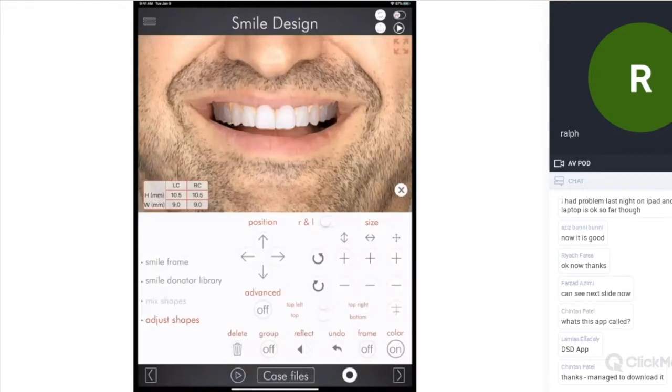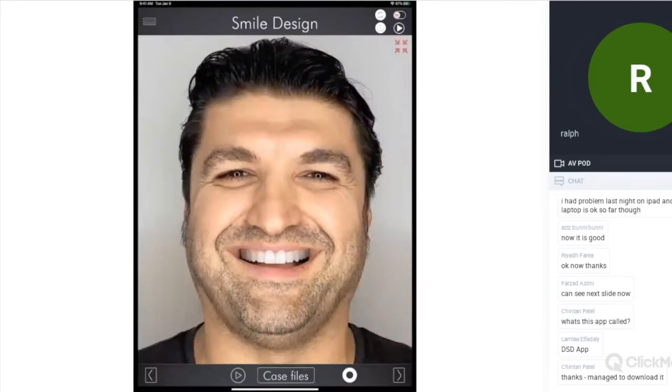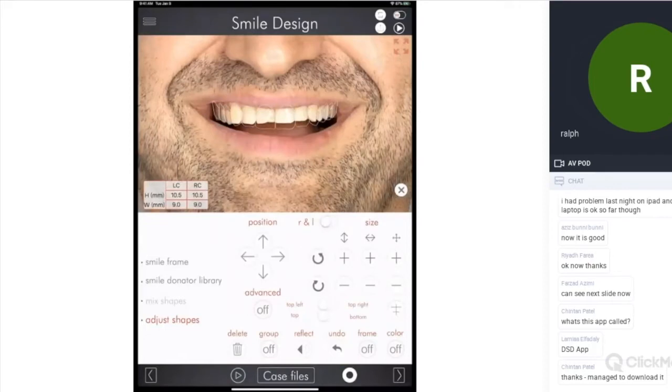And I go full screen and I analyze my smile in full screen, because what we do is called facial driven smile design. So I need to check with my full smile how my design looks. I check my outlines. I see the problems. I see I need to increase the vertical dimensions, right? I see that on one side, on the right side, screen side, or the left patient side, the distal lines don't match actually with my planning. That can be only one explanation.